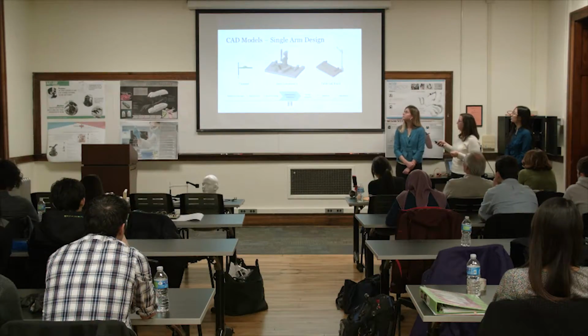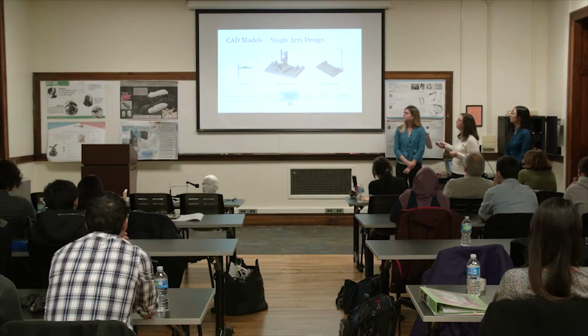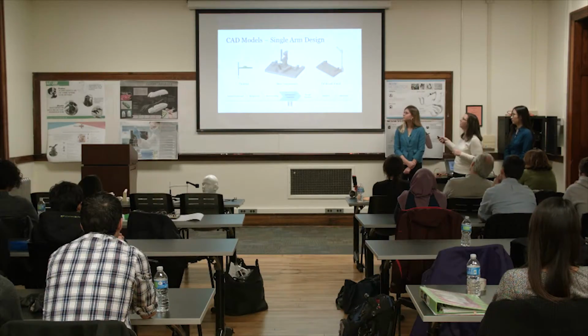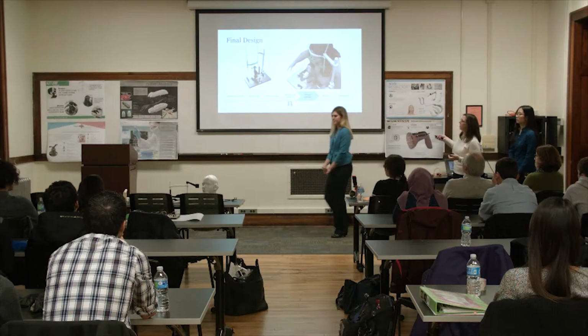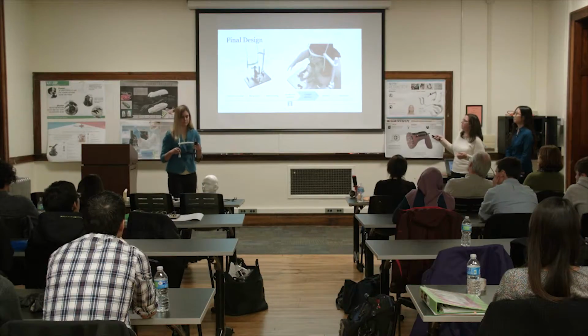So what we did was take another look at the base components. We modeled those in Fusion, and we made movements of those, which I'll show you in a minute. But just in eliminating the need for the feet of the chin rest and attaching it from the side and above, we were able to give some additional space here. As you can see maybe here, we cut the table back a little bit. So this was our final design, which we have 3D printed up in the front, where the chin rest attaches on the side and comes from here and holds the patient's head.